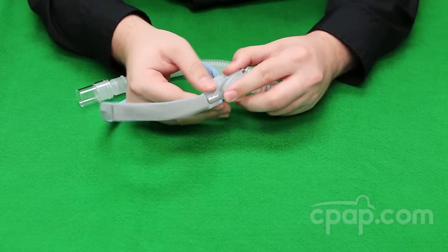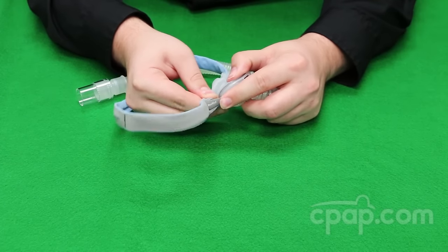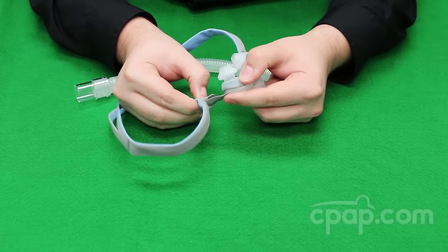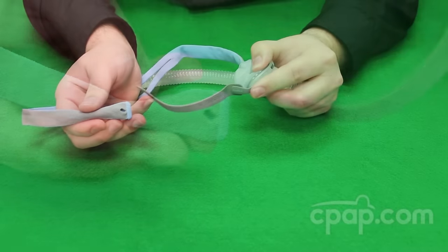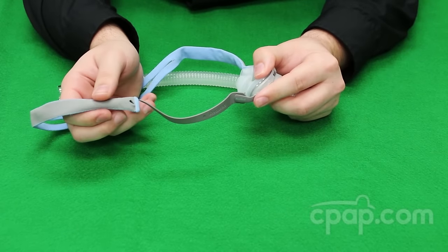To remove the headgear, pull on the fabric end to reveal the buttonhole, which will allow for the stabilizer to slide out of the headgear. Repeat this on the other side.